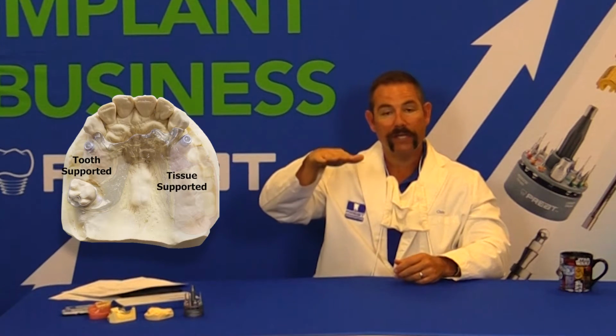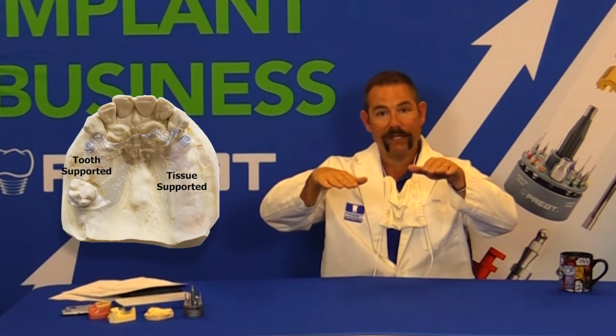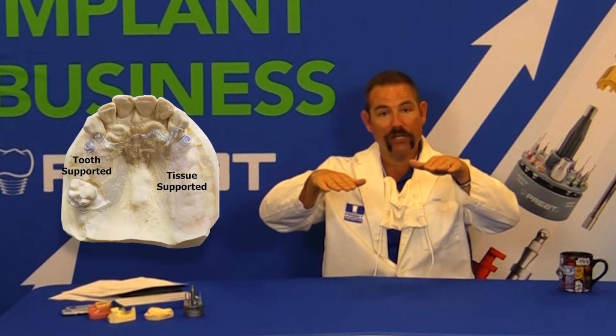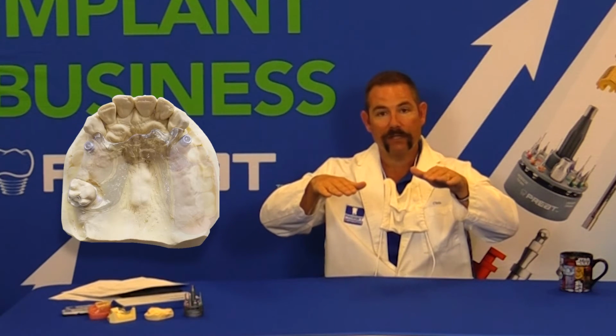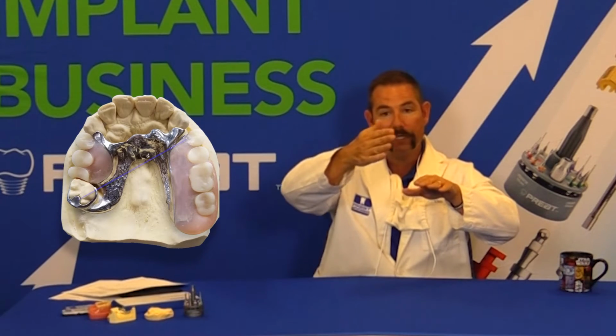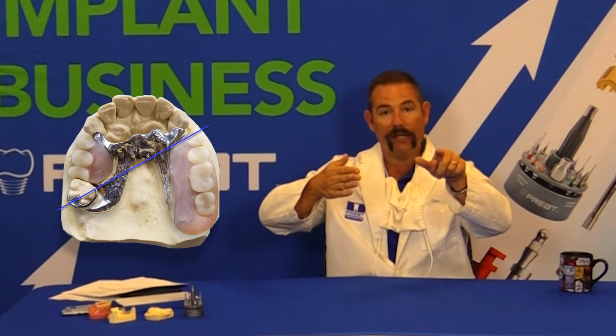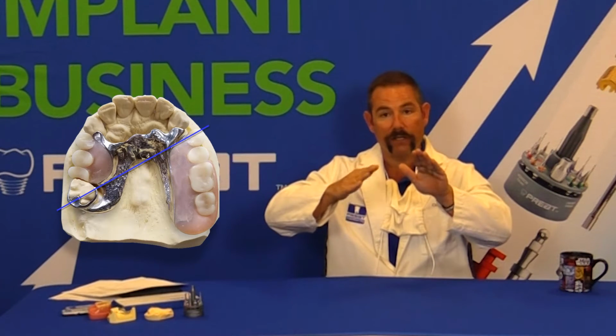You think about what's happening on the tooth supported side when the prosthesis is loaded, is tooth supported. There's no movement. But because these are connected, when the other side is loaded, the tissue supported, it's going to flex. We get much more movement, as we know, from tissue as we do from natural teeth. So when this side wants to move, this side is fighting against it. There's a fulcrum between that terminal abutment and our last abutment on the free end side. That's the fulcrum for the rotation.